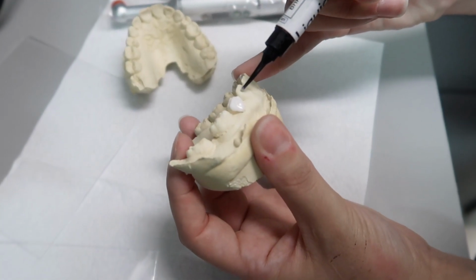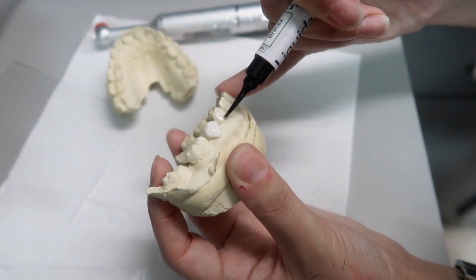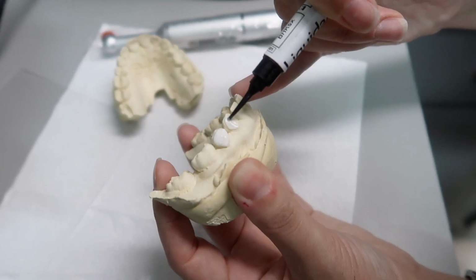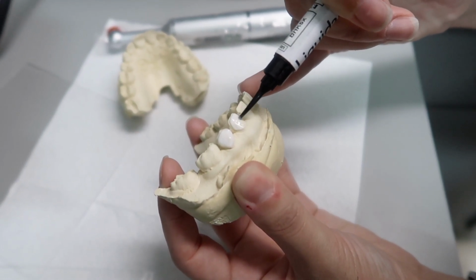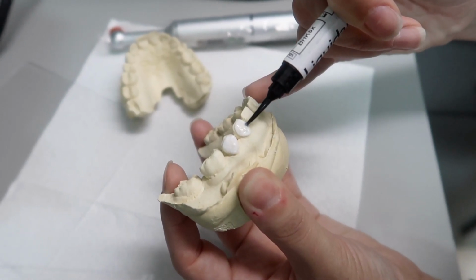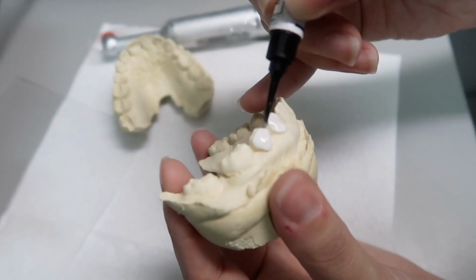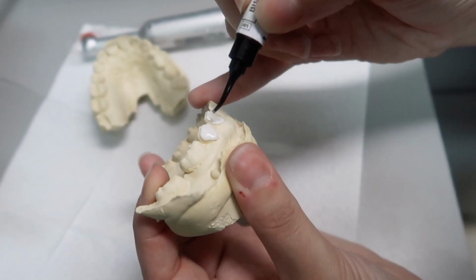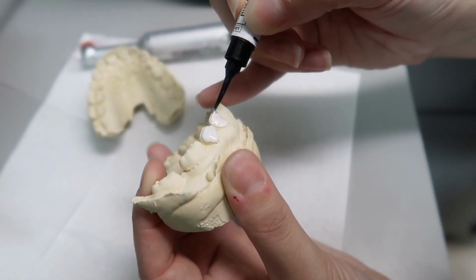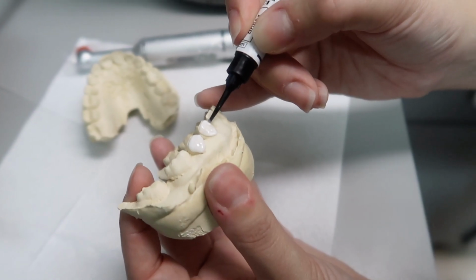Yeah, because sometimes when you pull out the liquid dam, you're putting in material and pulling out, a little something sticks. But then when you cure it, it's hard. So then when you make your whitening tray, it creates a hole through, and you don't want that. See, she's smoothing it out. And I don't go interproximally too much, because that's how you get sensitivity. I just do it really just on the facial.